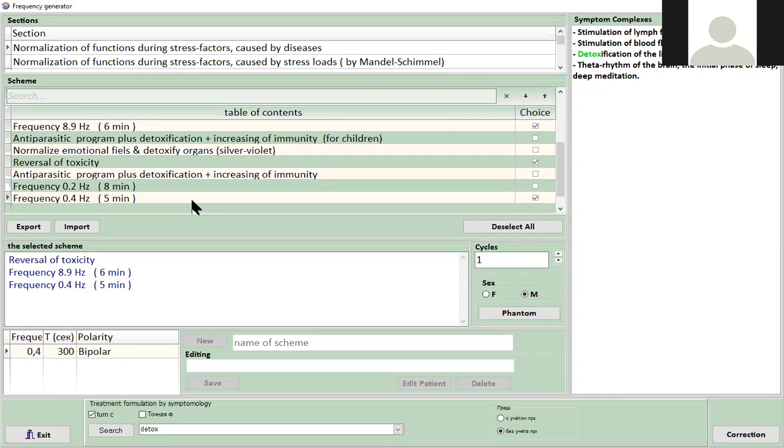Victoria, with the metal strips, you keep them in a tin foil, so it keeps the program. How easy is it to lose the programming? If someone touched it with their hands too much, or if it fell on the floor? We use these ones. It's better not to touch them after they are downloaded. So I usually have the prepared ones in this metal box, and they are cut like this.